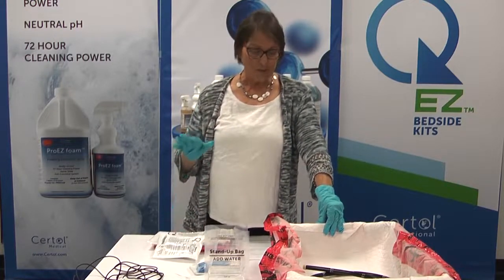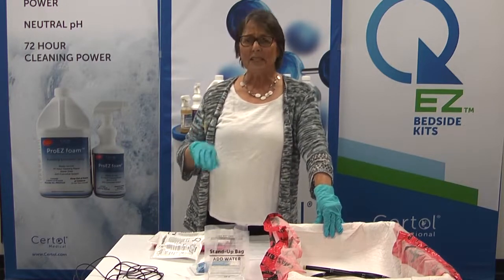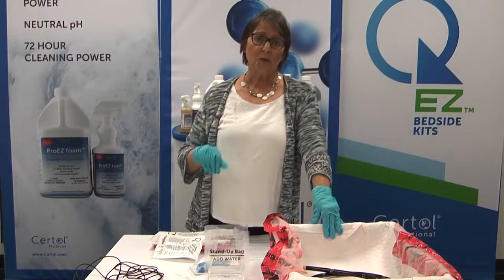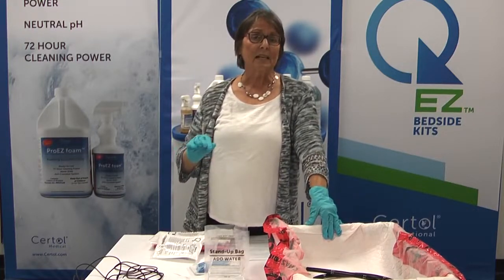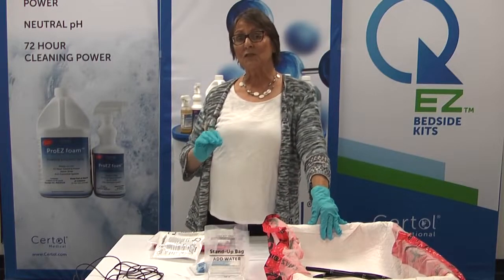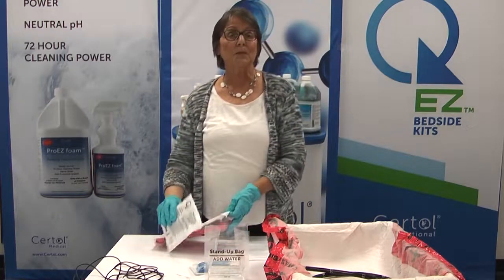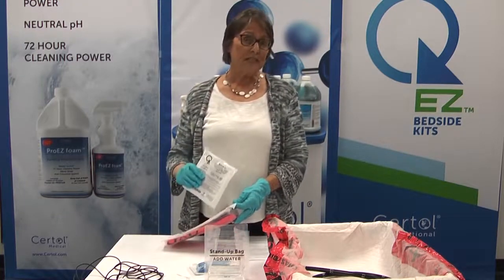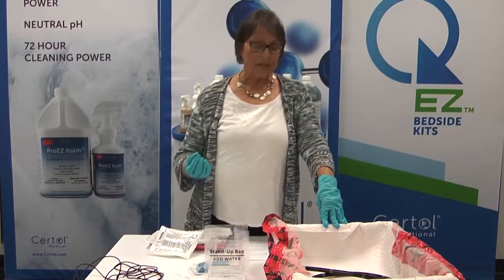We have several challenges with endoscopy and immediate cleaning, and the biggest challenge is preventing dried soils that may lead to biofilm. We know from research that there is a high rate of potential patient infections from allowing soils to dry inside of endoscopes. So Certol is presenting this product as a way for your facility to deal with this dried soil problem immediately after patient treatment.